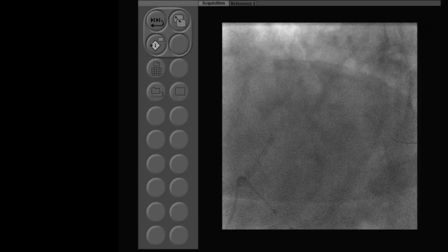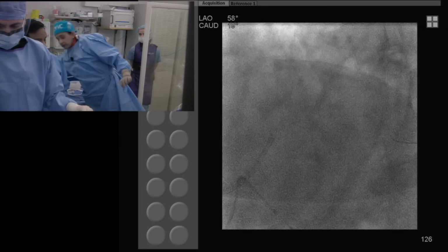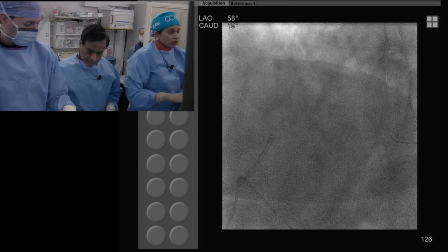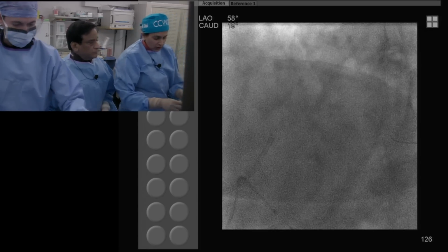So, the left main did not look critical at the level of the left main, but it's not going. I think we take the wire out. Either way, we cannot do anything to the circ. Right now, no. But the question is, do you need a Supercross to make a turn for the LAD? No, I'll try again with the same Fine Cross, and we'll go with a Miracle with an acute angle and see. If not, then you have to use a Supercross.